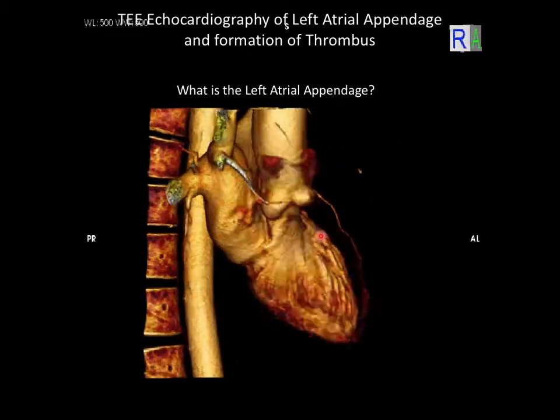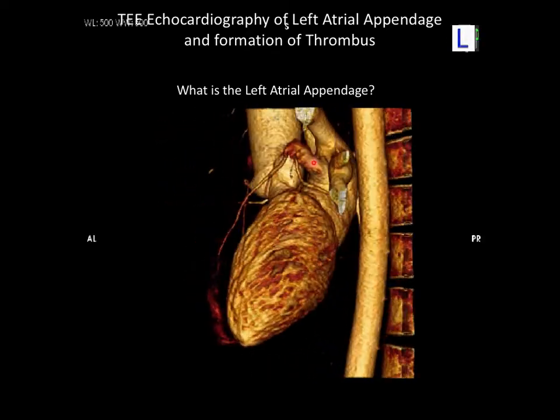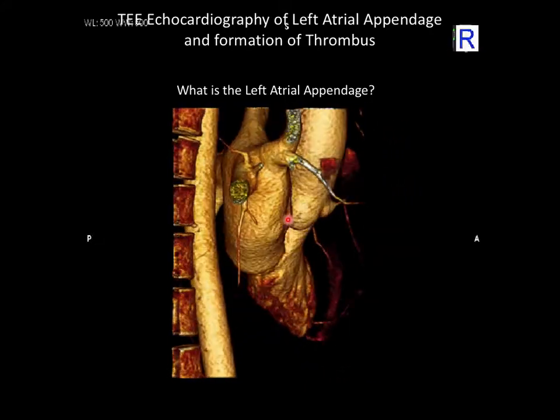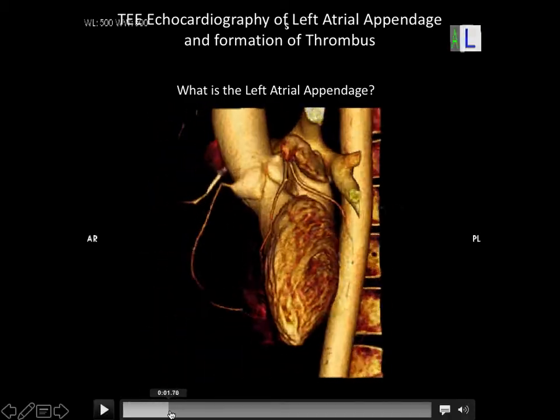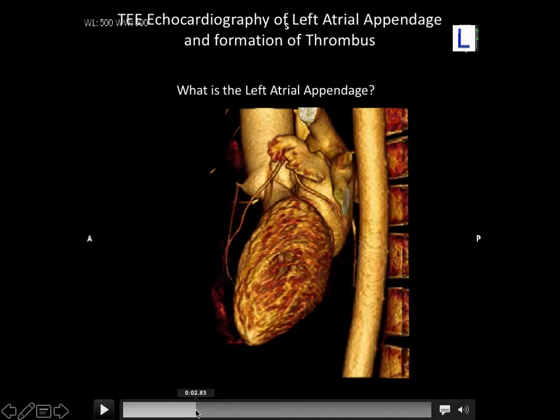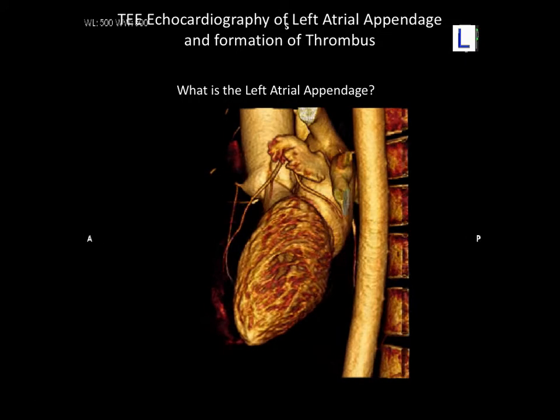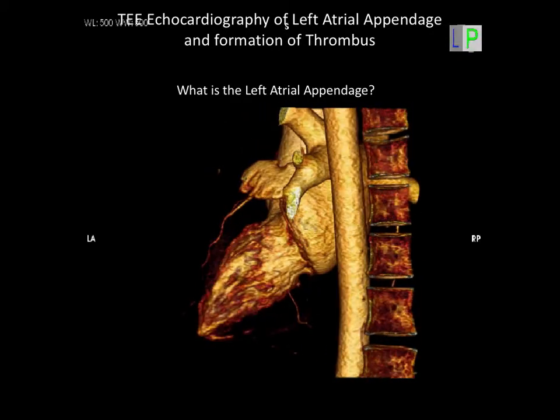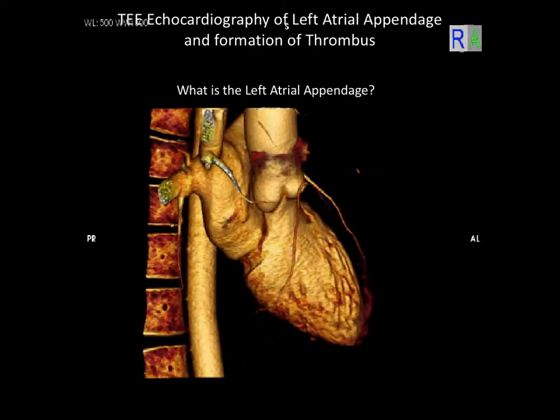What it shows very, very clearly is sort of normal ventricular contraction, but also that thing right there is the left atrial appendage, right? And it shows you how much it's actually contracting on each beat, which is pretty cool. This is something that is not commonly done for patients. So if you look there, it's full of blood. There, it's not. It's ejected about 50% of the blood there. This is not done clinically to determine whether or not a left atrial appendage is functioning normally, because it's too new to be in the clinical pathway.